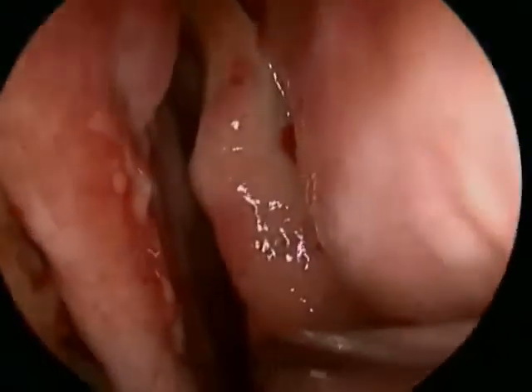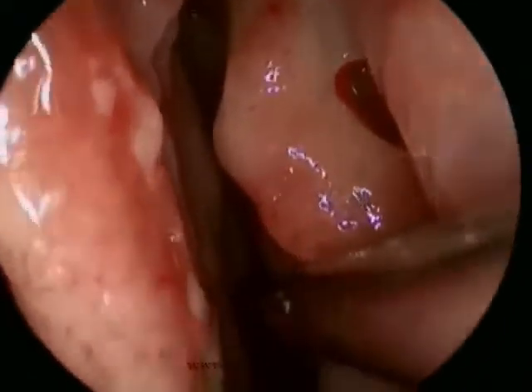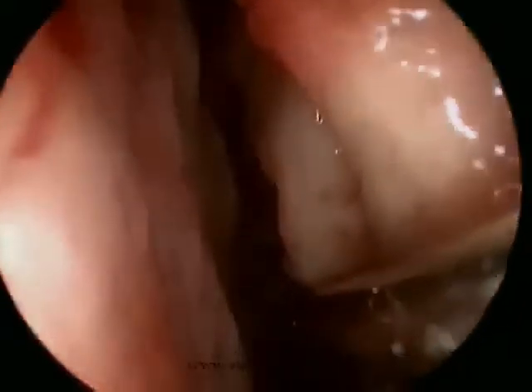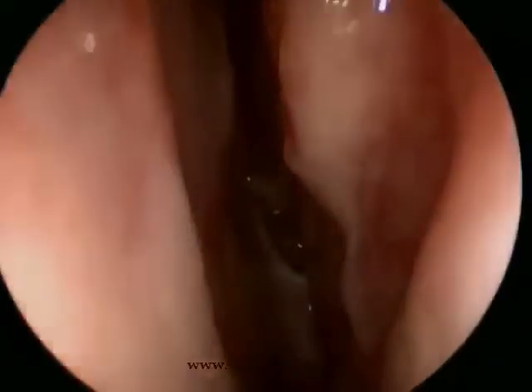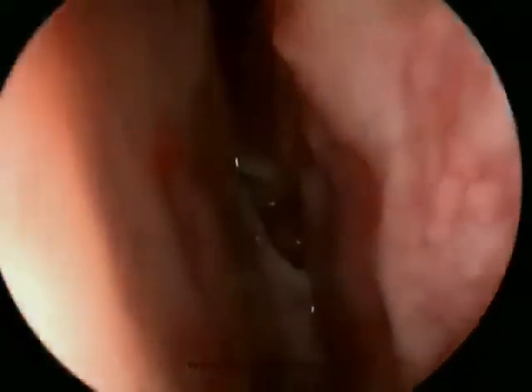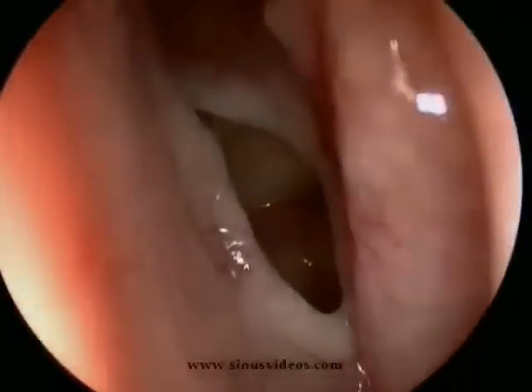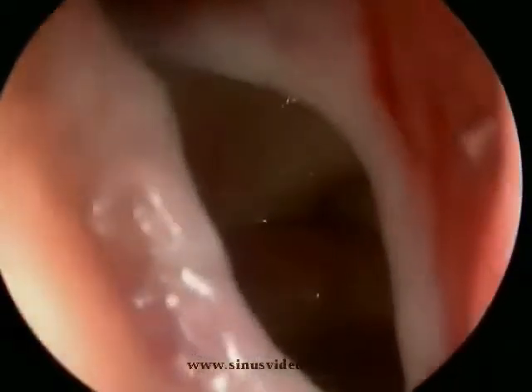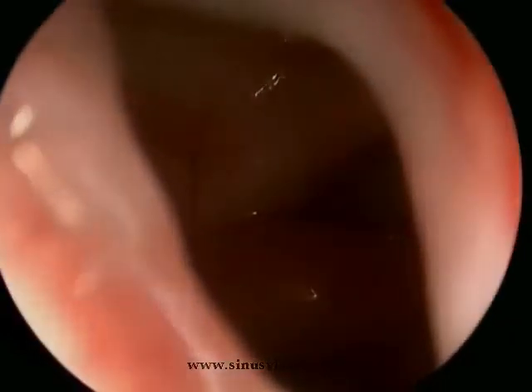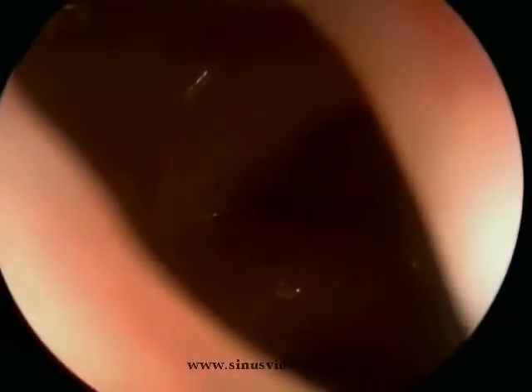The impression of the carotid artery can often be seen in the lateral aspect of the sphenoid sinus depending upon the extent of pneumatization. Here, a 30-degree endoscope is passed medial to the middle turbinate. The ostium of the sphenoid sinus can be seen as a slit-like opening. The endoscope is passed gently through the ostium and then pointed in the lateral direction.